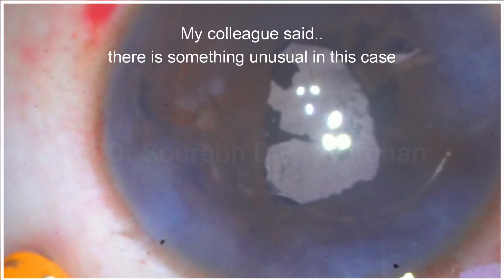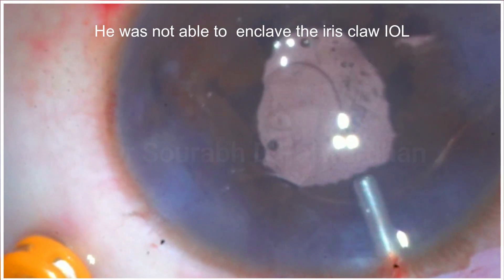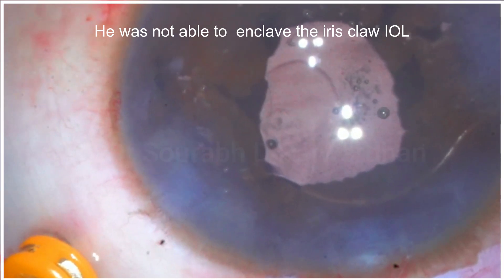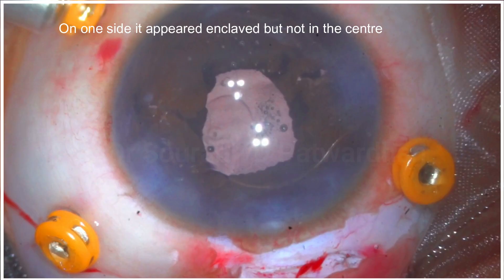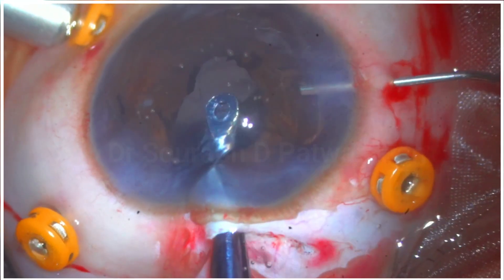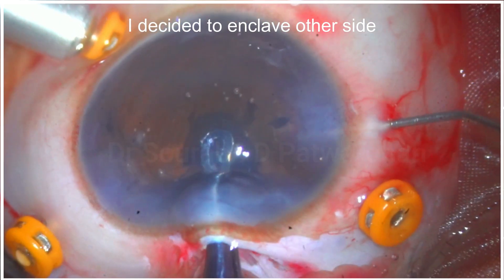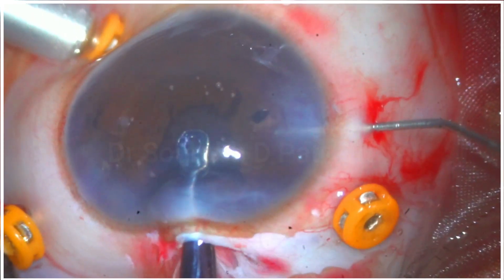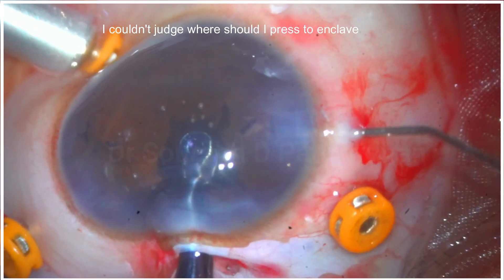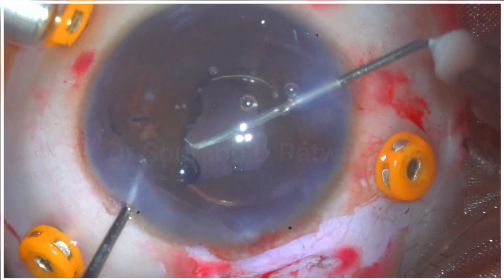After about one hour, I was called back to the operating room. My colleague — an experienced surgeon who has done many iris claw IOL cases — said there was something unusual and he was having difficulty. When I checked, I found that on one side the IOL appeared enclavated but not centrally, so I decided to try to enclave on the other side. However, I couldn't feel the claw there at all.